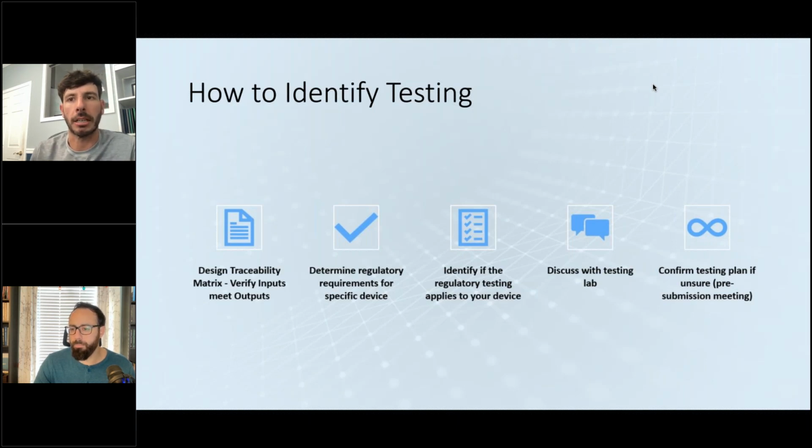And with software, there is a lot of overlap between DMR and DHR. DHR for a traditional hardware device is the actual record of you building it. With a software device, it really would be that record of you making this new version of the software accessible, whether that is when you uploaded it, whether that is when you added this new version of the software to your hosting site or whatever it might be, or uploading it to your hardware as far as software or firmware. All that information will be part of your DHR for your software.